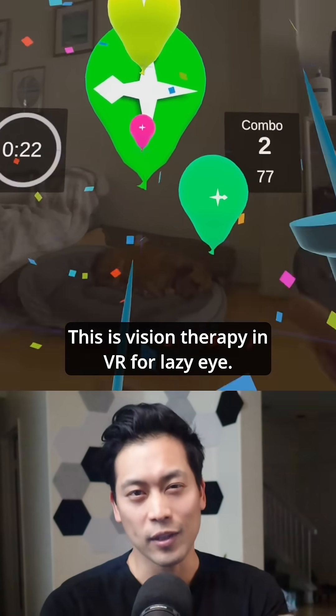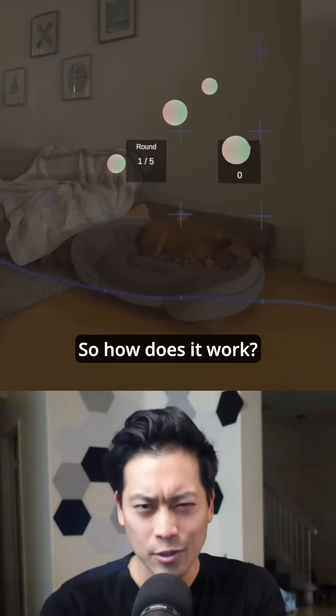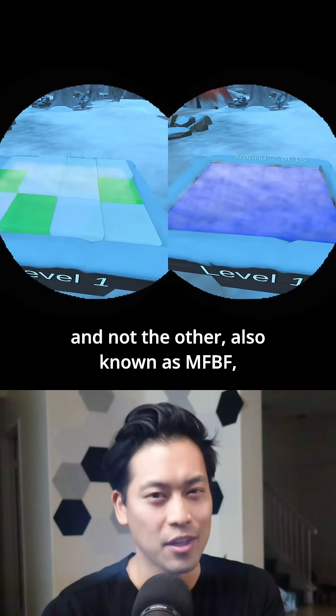This is vision therapy in VR for lazy eye. All you need is a MetaQuest headset. So how does it work? In VR, each eye has its own display. This means we can show important targets to one eye and not the other.